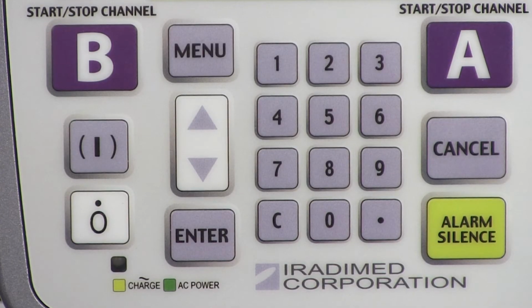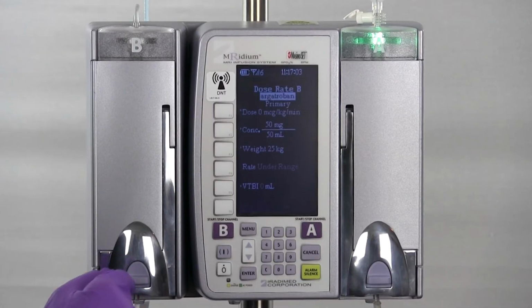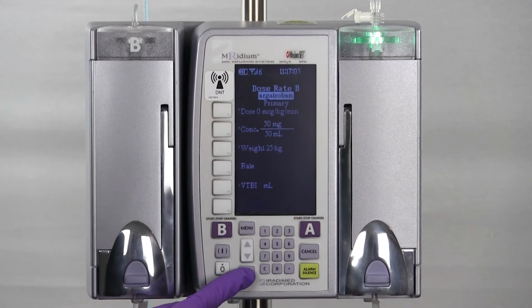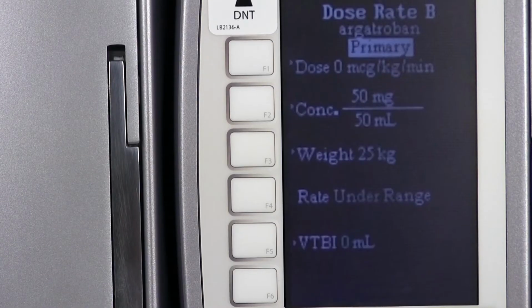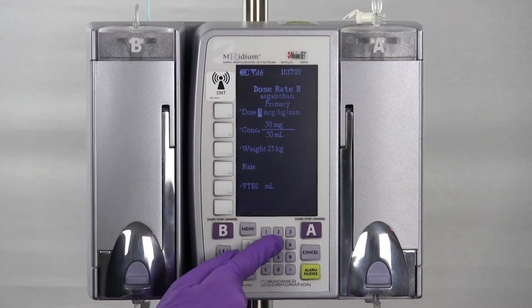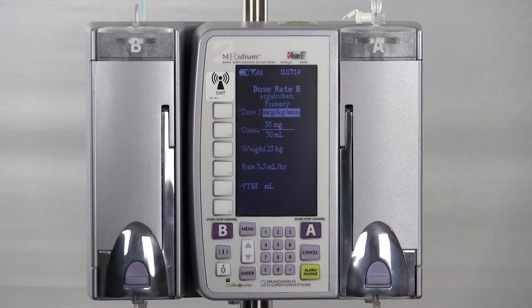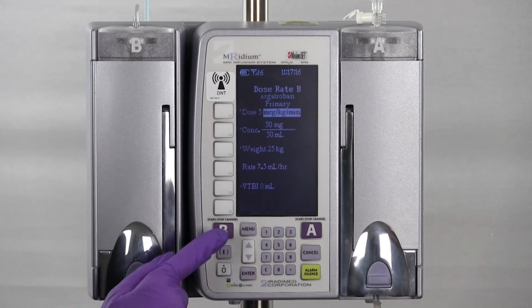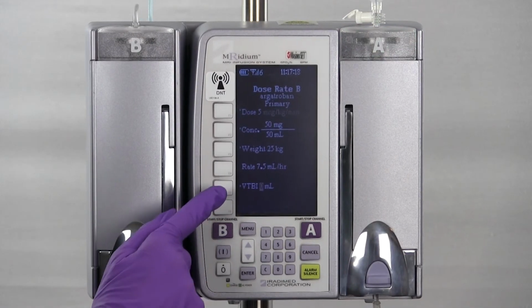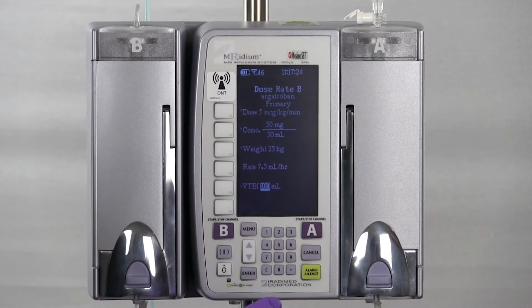Using the up and down arrows, the user will scroll to find the patient's prescribed medication. Once the appropriate medication has been found, the user will press the Enter button and then press the soft key adjacent to Dose on screen. Next, the user will key in the dose and press the Enter button. The concentration will already be pre-programmed. The user will then press the soft key adjacent to Volume to be infused and enter the volume to be infused using the numeric keypad and press the Enter button.